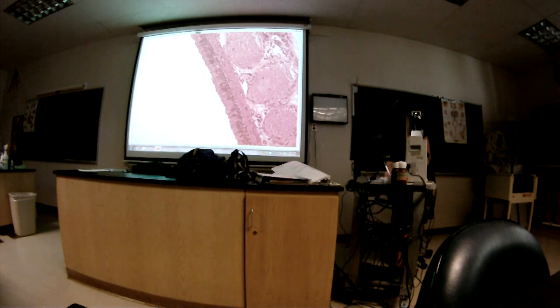Okay, so question 1, let's review. I'm not going to put them all back up. Question 1 was, what was that organ? Uterus. Question 2 was, what was that main layer? It was the innermost one. Endometrium. Question 3 was the structure. Uterine gland, or endometrial gland. Question 4 was what kind of tissue, and I was pointing at the middle main layer. Smooth muscle. The name of that layer would have been the myometrium.